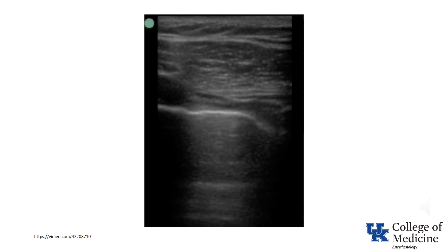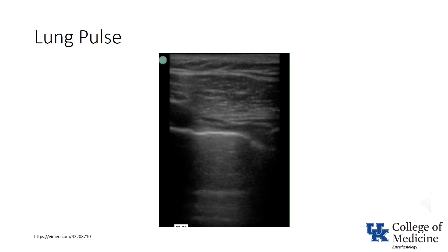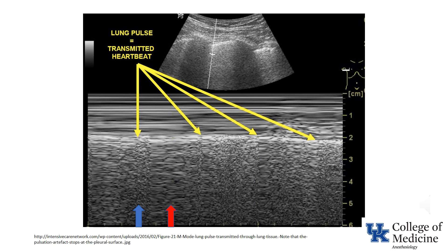Watch this video for four or five seconds and answer the question of whether lung sliding is present or absent. While there is clearly motion of the pleural line, it is synchronous with the heart rate, not the respiratory rate. This is termed a lung pulse. This M-mode image of a lung pulse clearly demonstrates that the image alternates between a seashore sign (blue arrow) and a barcode sign (red arrow). The presence of a lung pulse indicates that the underlying lung is not being ventilated.